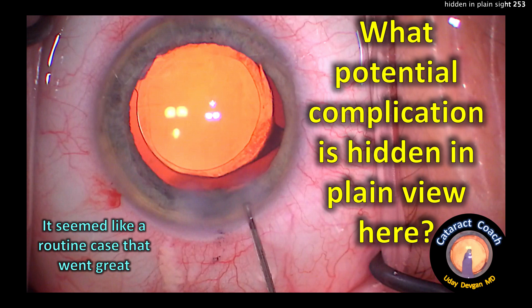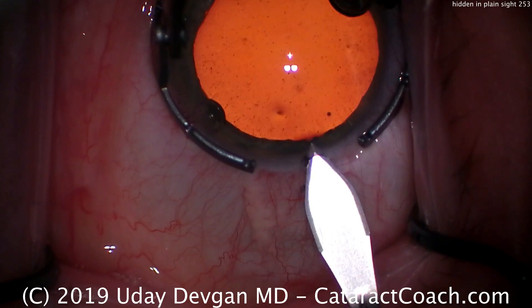cataractcoach.com. What potential complication is hidden in plain view here? Look carefully, it's right there. It's hard to tell.